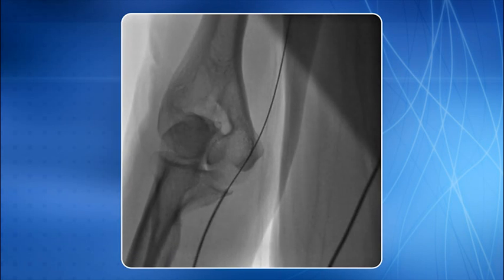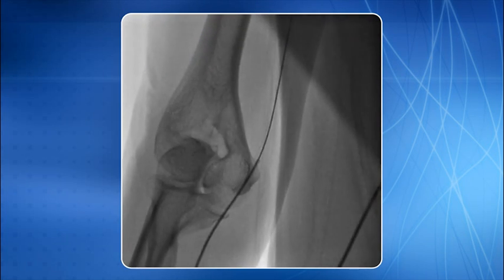Now, the catheter is negotiated over the wire. You can notice something very important. When you are negotiating a catheter through the calcified segment, make sure that you do not push. You have to do a gentle corkscrew movement to eliminate the friction generated by the calcified segment, and this is how you can negotiate the catheter very nicely over the wire. Once the calcified segment is crossed, there will not be any resistance and the catheter will move very smoothly, and the procedure can be completed in usual fashion.